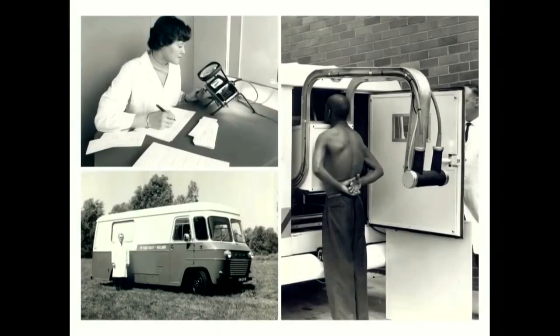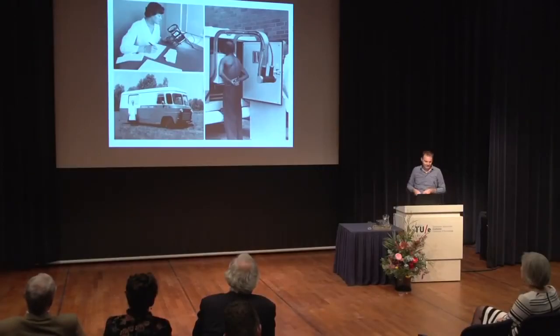And there's one really big drawback of this analog X-ray, that it's very expensive. These films are really expensive. So the moment that radiology digitized, actually the price of silver dropped, because there's a lot of silver in these screens. And to make these films cheaper, they did what you see on that picture over there. They actually made very small films, 10 by 10 centimeters, and then put them on a magnifying glass, and this is how you would read TB screening cases and then fill out the results on an envelope lying there, and then you put the film in there.